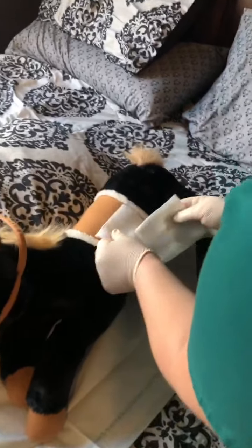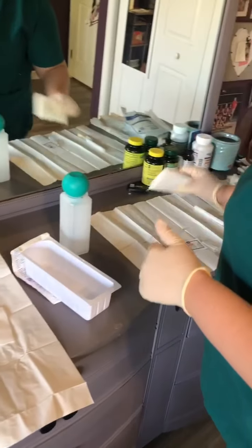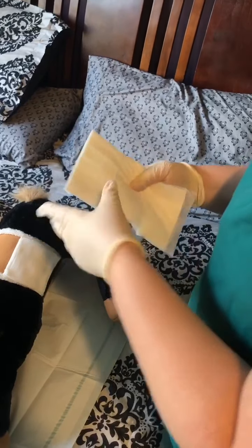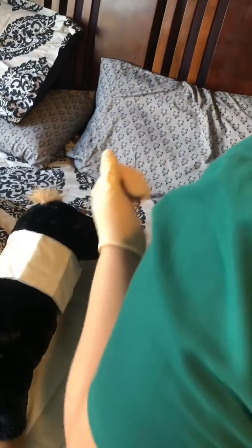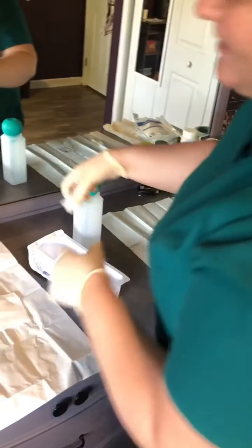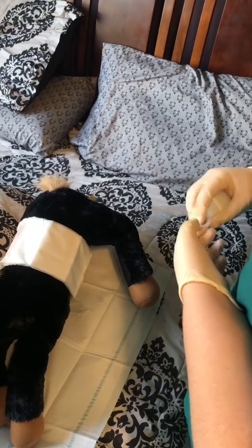So these would go on the outside. 2 4x4s, and then the ABD pad. I'm going to secure that with my tape. And on my tape I will put my initials and the date and time.